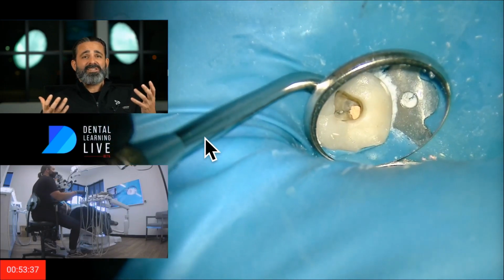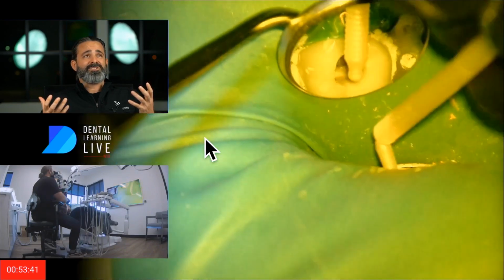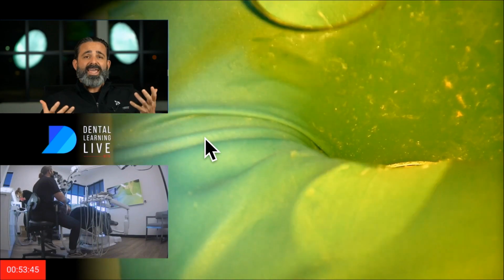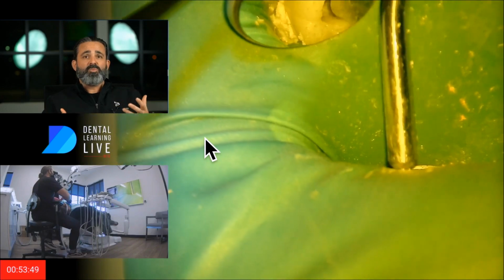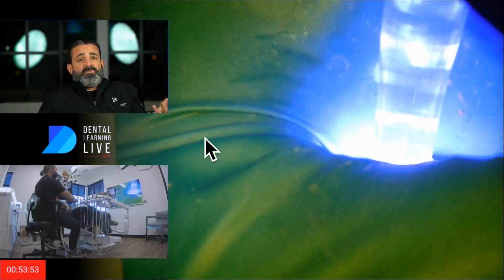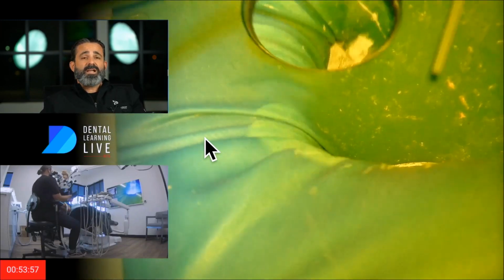And maybe I'm a scent guy. I like good colognes, fine colognes, and I don't like odorous teeth. Odorific's not good in my book. So I hated that, and then I would always feel compelled to do more. And what I found since I've adopted the GentleWave, I don't run into that. It smells like Mr. Clean, like he's cleaned my kitchen floors. It just has that clean smell.